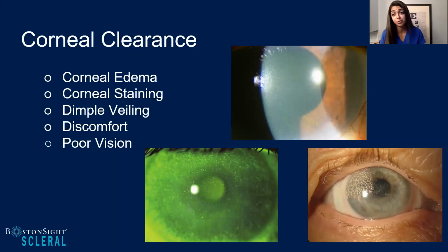And then lastly, poor vision. So we obviously know that fogging is a big issue with scleral lenses, and oftentimes this can be due to the quality and quantity of your tear meniscus height. And a lot of this can be related to your corneal clearance. So one is assessing how much, but two is looking at the quality of that tear meniscus. How much debris, how much fog do you have in that, and how is it affecting your patient?